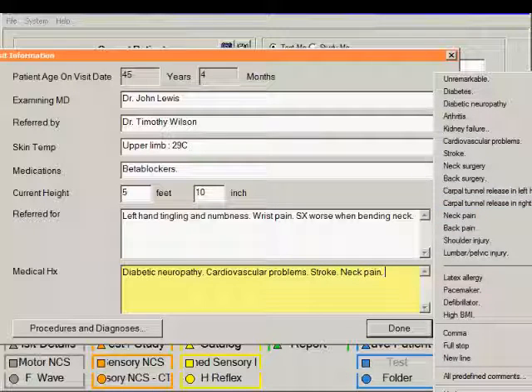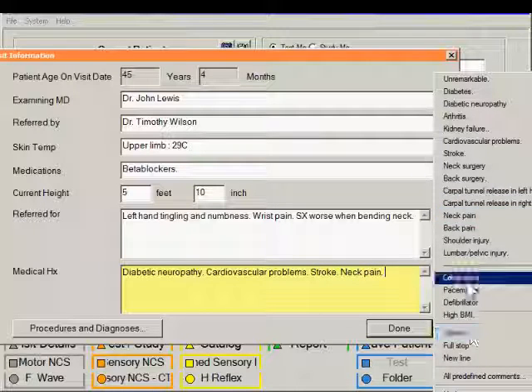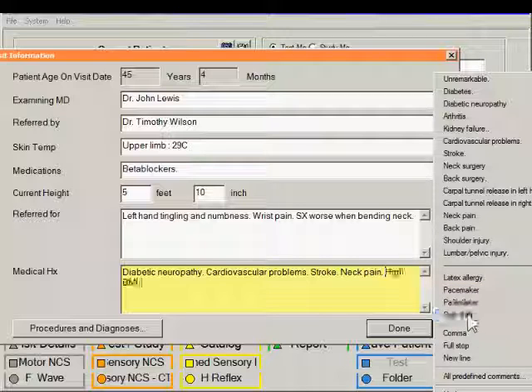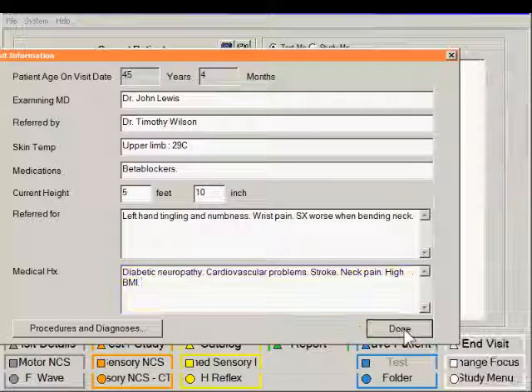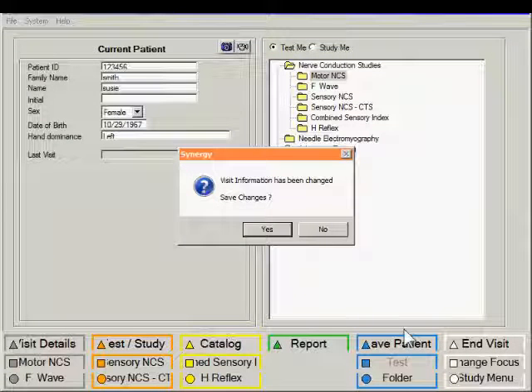And when you have completed this, you can just click the done button to close this window down.